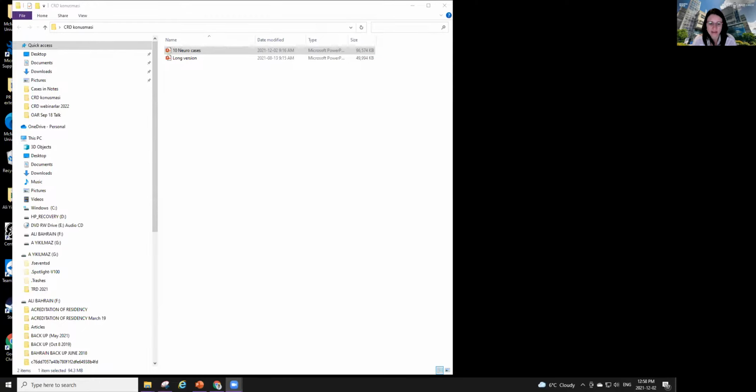The experience that we have, and that I had as a fellow at Sick Kids and in my current practice at McMaster, is that I feel ultrasound is a much more sensitive method than X-ray to detect portal venous gas and even pneumatosis sometimes. So if you have a case of bowel perforation, I had 2 cases where I was able to detect it much earlier using ultrasound, detecting a very small pneumoperitoneum, than with X-ray.